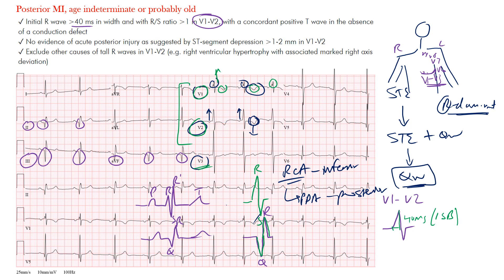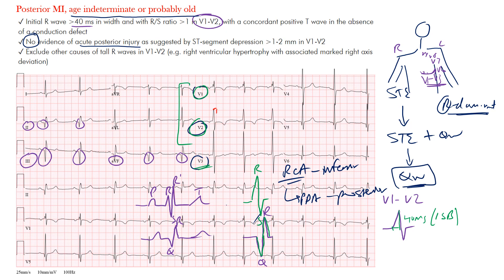One key point: in leads V1 and V2, you do not want to see any ST segment changes when you have an age-indeterminate or probably old posterior MI. No evidence of acute posterior injury — so no ST depression. Notice there's no ST depression in these leads at all. The main things: the initial R wave is wide, and the R-to-S ratio is greater than one.